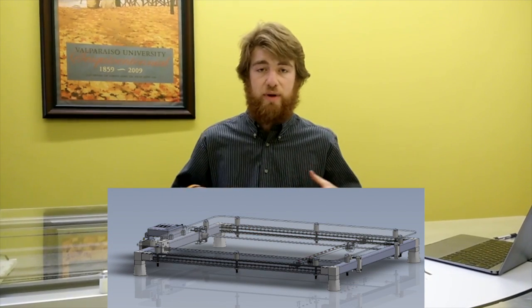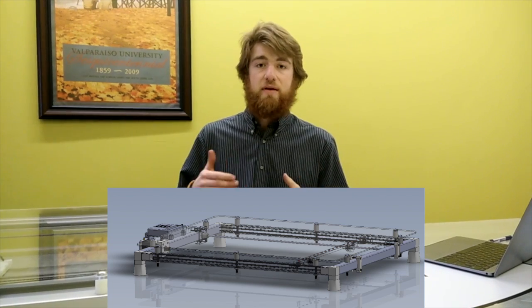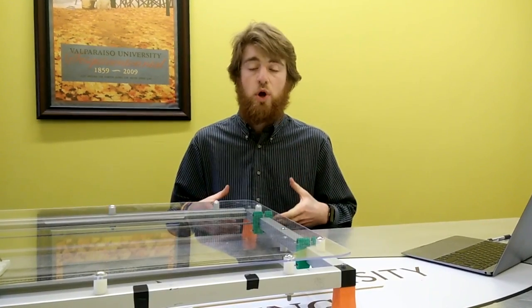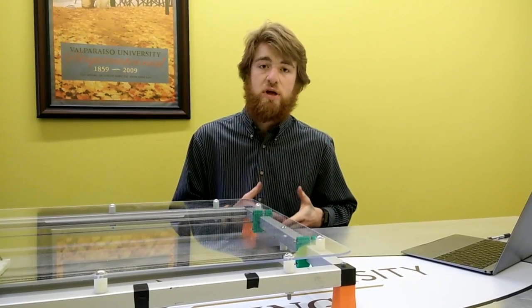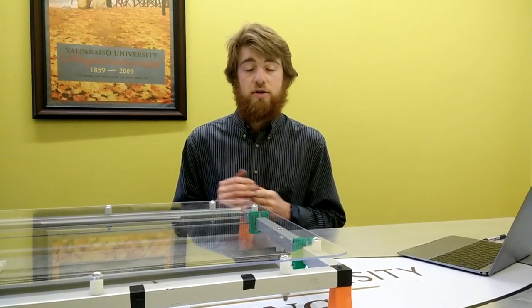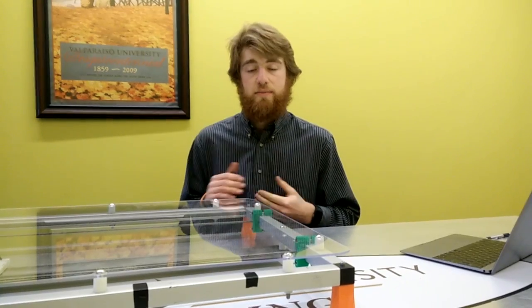The third way was to take a total light reading of the area where the infant was lying in the crib, and then subtract the amount of energy hitting the infant from that. We decided to go with the third approach because we found it to be the most robust in order to suit a variety of different infants and sizes, and also a variety of different cribs. Therefore, we designed a scanner to measure light energy.